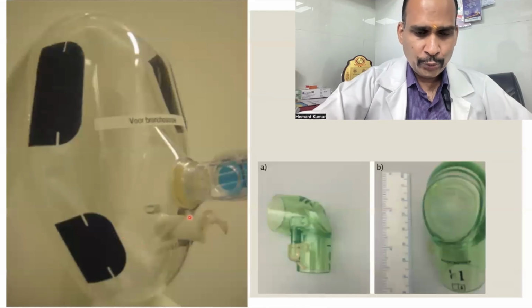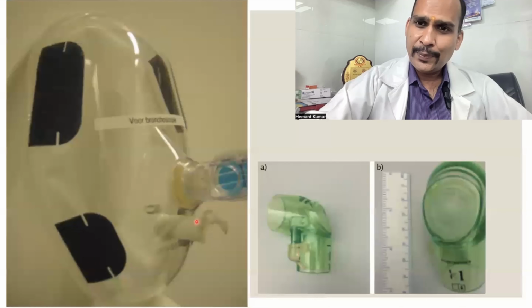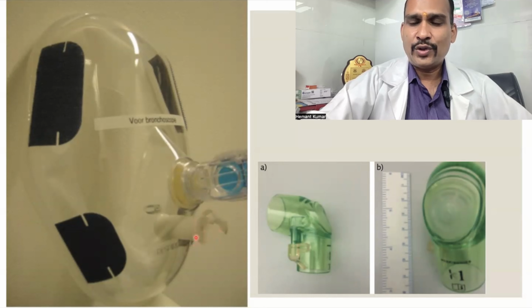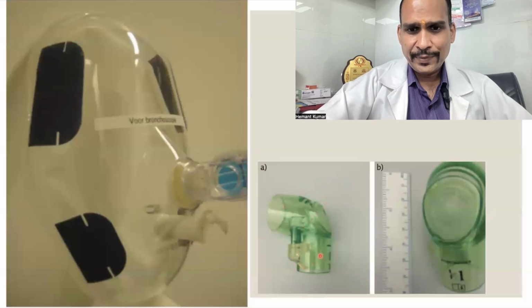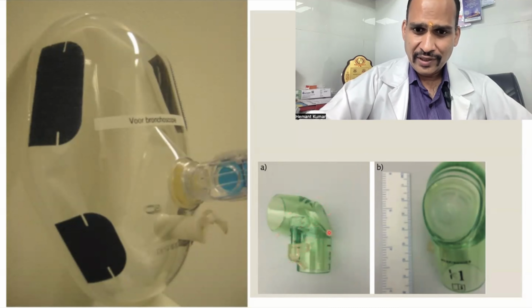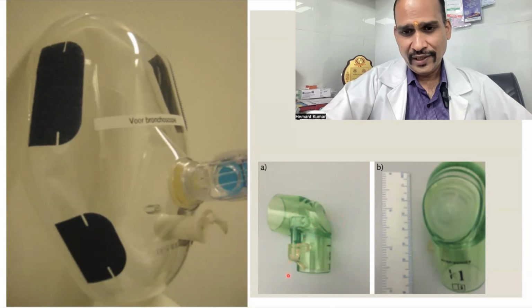For bronchoscopy, there is a special type of mask. This is the extra port; through this port we can insert the bronchoscope. Or, in a traditional NIV mask, we can use this L-shaped connector. We attach NIV to this port and insert the bronchoscope through this port.